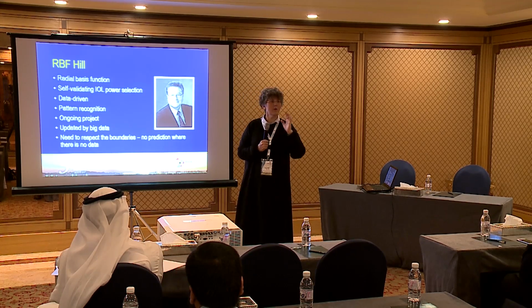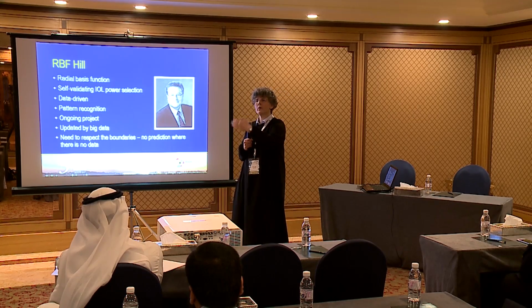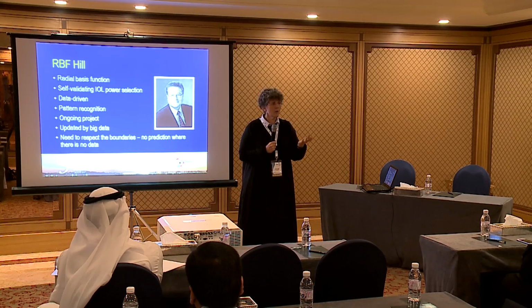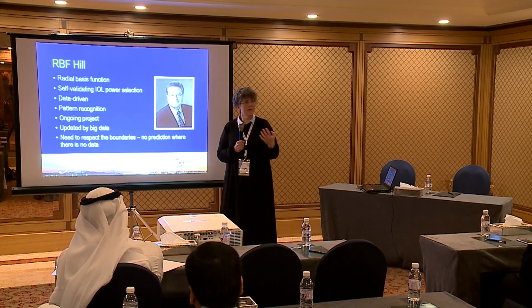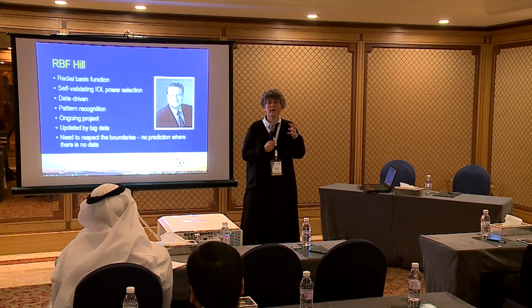And from this data, he has an algorithm, so you put in data, you use it to make your next calculation based on what you got in the previous, exactly. And this you can improve all the time, so you need more data to come in. So for the normal eyes, he has enough data. For the eyes that are more rare, that are beyond the 2 standard deviations of what we have in our populations all over the globe, this is still not completely okay. So for diopters under 6, I think, and over 30, his formula may be off.